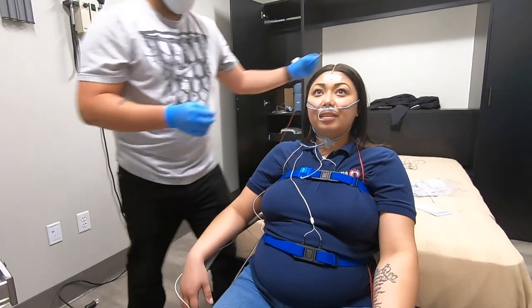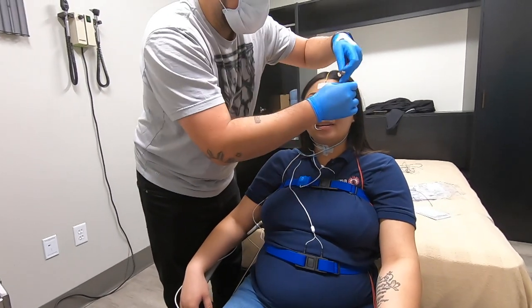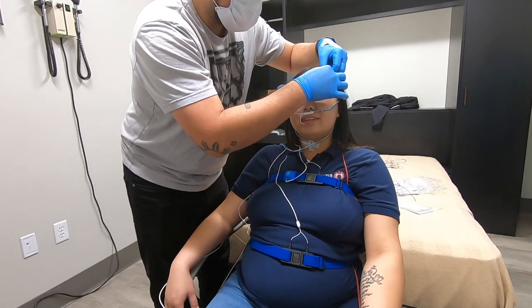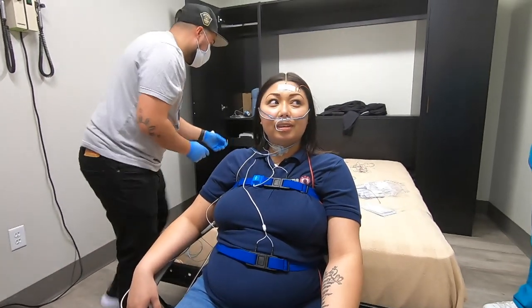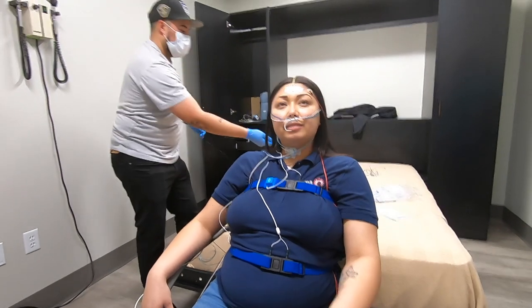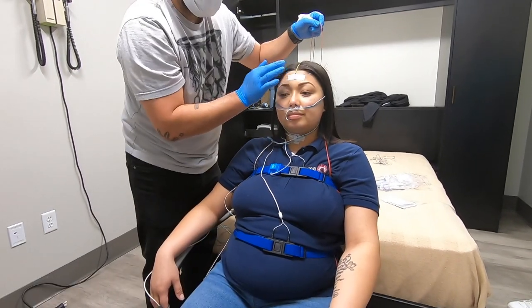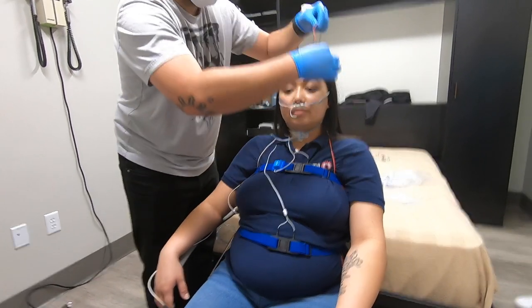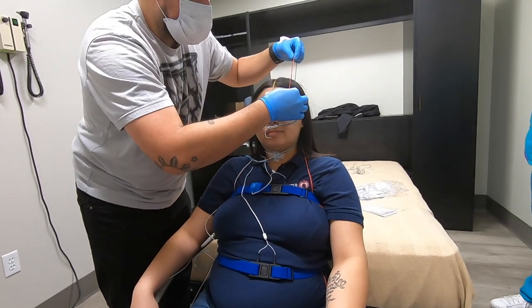She also has three EKG patches — two on the upper shoulders and then one on the lower left rib. The two belts that are on are called effort belts. Those are used to determine breathing, or effort of breathing.